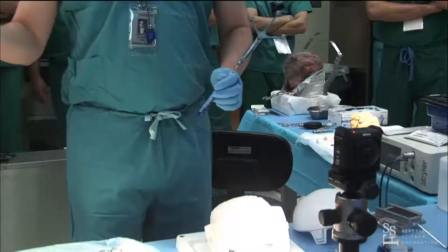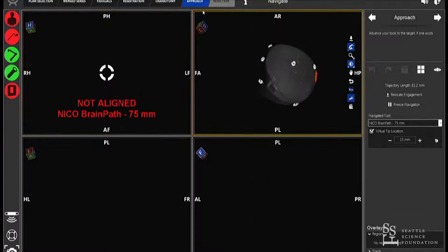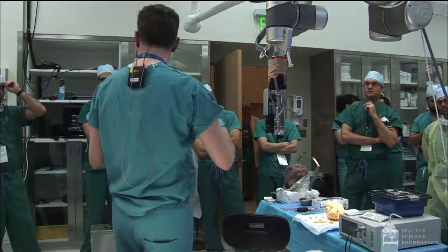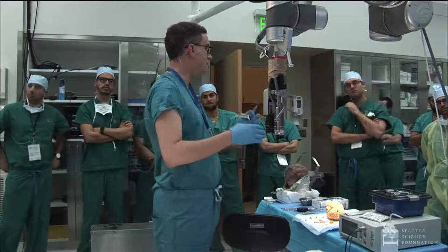Switching to the Synaptive system: we again have a fake target. Earlier in the workflow you would have planned and drawn out your tracks. This system plans tractography differently — rather than seeding an origin and destination for one track, it maps out all the tracks in the brain in real time, and you can then cull them back based on how dense they are and whether they're intersecting.